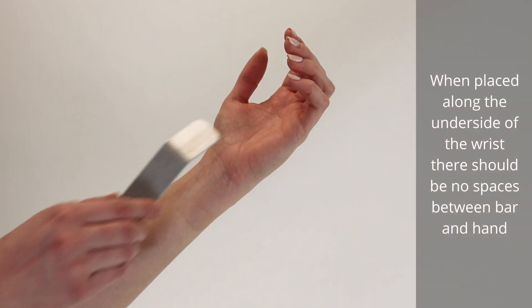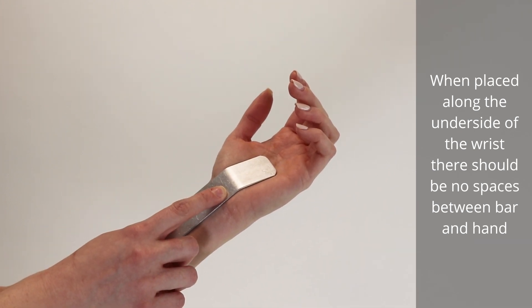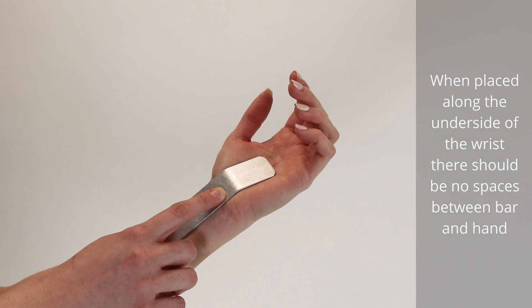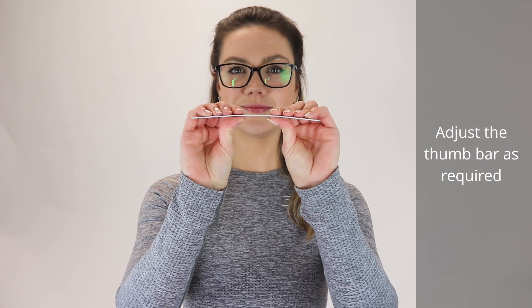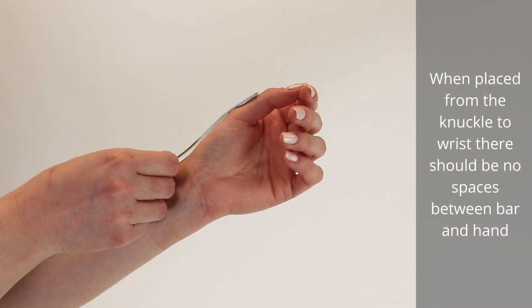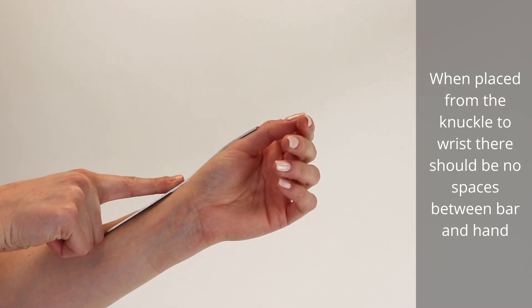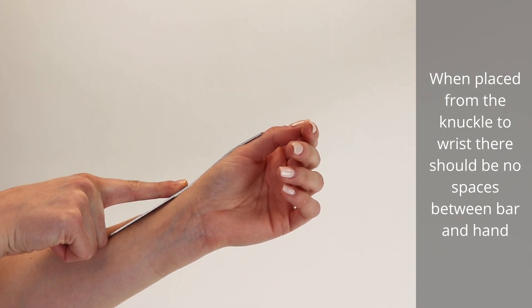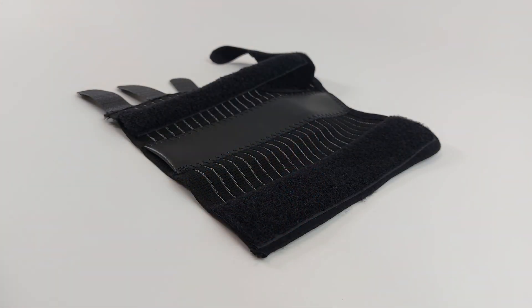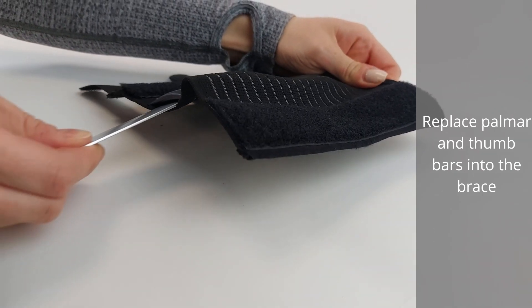When placed along the underside of the wrist, there should be no spaces between the bar and hand. The bar can be adjusted as required. When placed from the knuckle to the wrist, there should be no spaces between bar and hand. Replace the palmer and thumb bars into the brace.